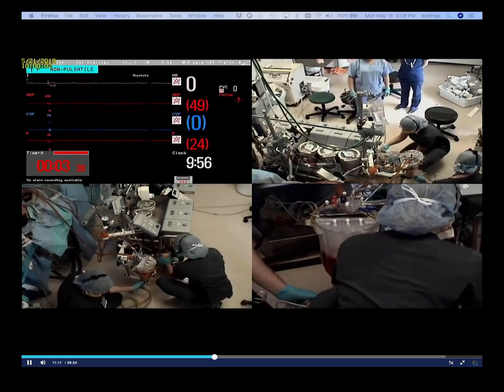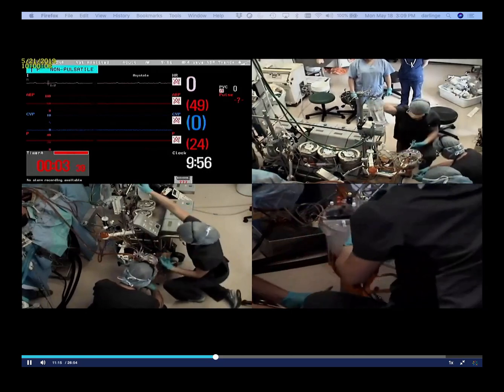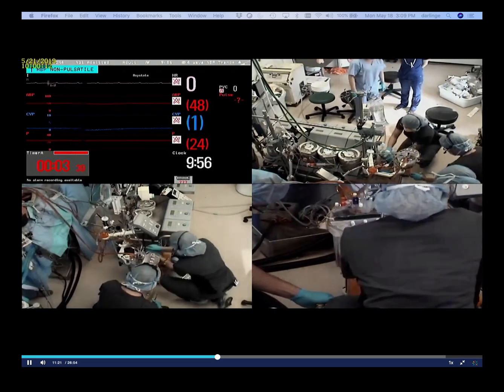It's been a while on cardioplegia — I'll be able to give you some cardioplegia here in just a moment. Bleed out a little of the water. Okay, next one's a hot shot.